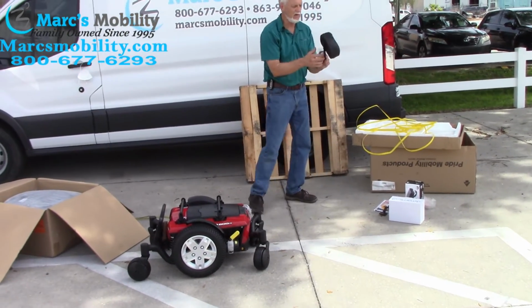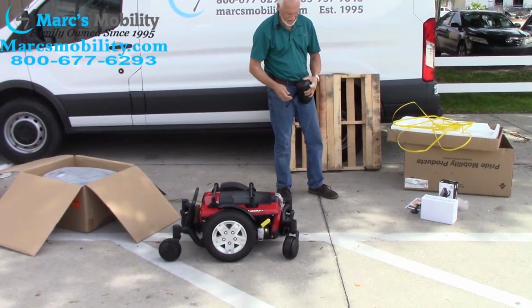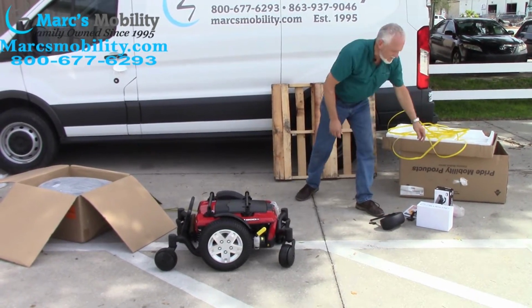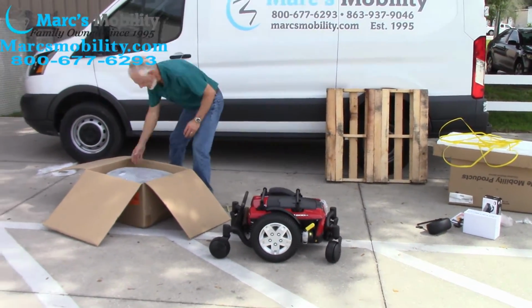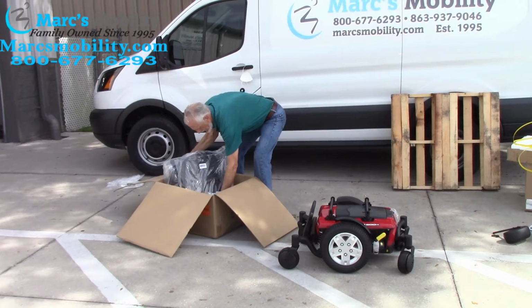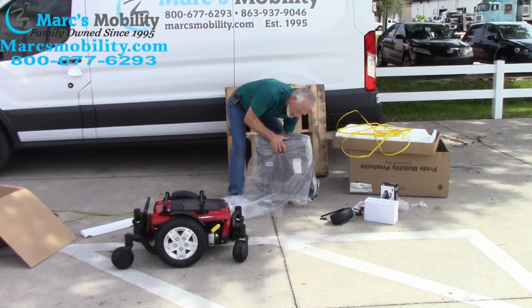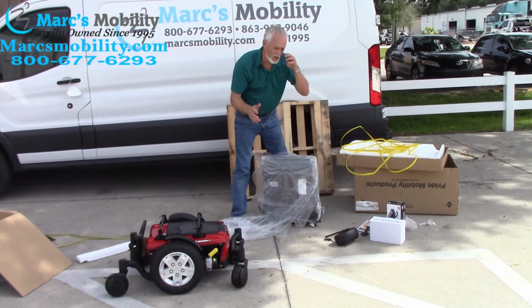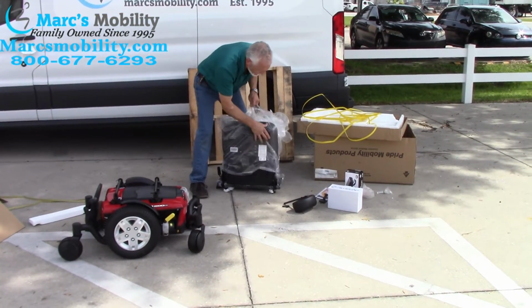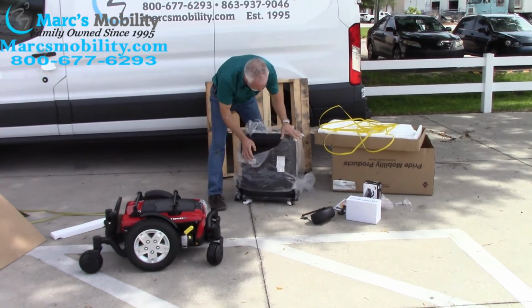On your headrest, you will have a little clip right here. You need to have that clip. Don't lose that clip right here. It's tied on the headrest. It's your little clip to take so the headrest doesn't wobble. Now the seat. You're going to take the seat out. The seat weighs about 35 pounds, so it's not hard to put together. You just have to have a little bit of strength. So if you don't think you can lift these pieces, don't try. Get someone to help you. It's not hard, especially with this video.